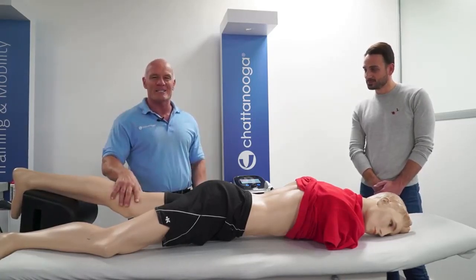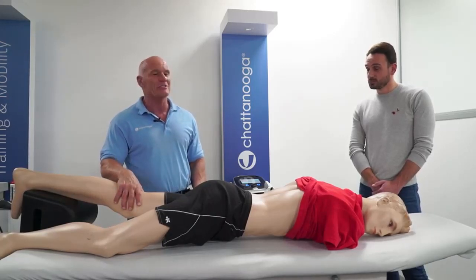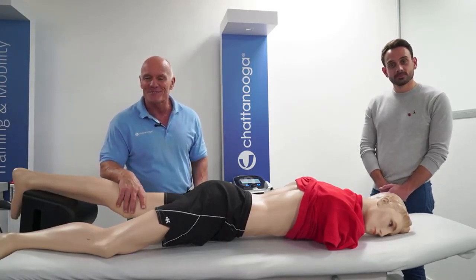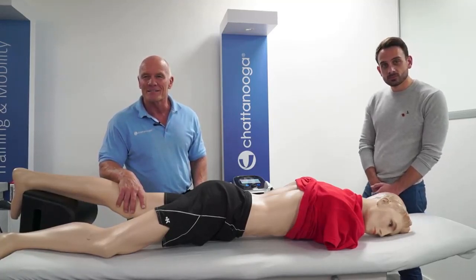And we have a question apparently, sorry. Can't say his name, Ihor. He says, hi Cliff, superb presentation, well done, thanks. How long does the transmitter live, or how long does the transmitter last?